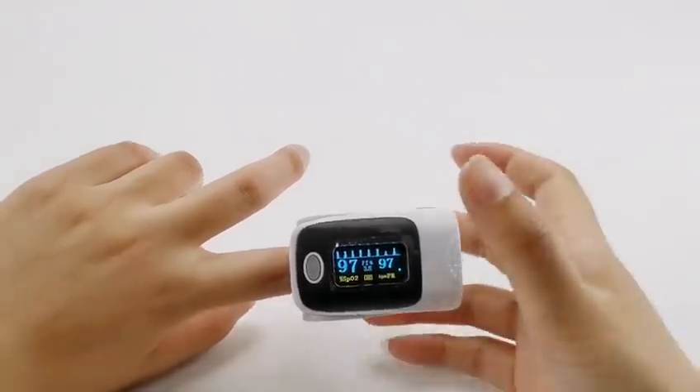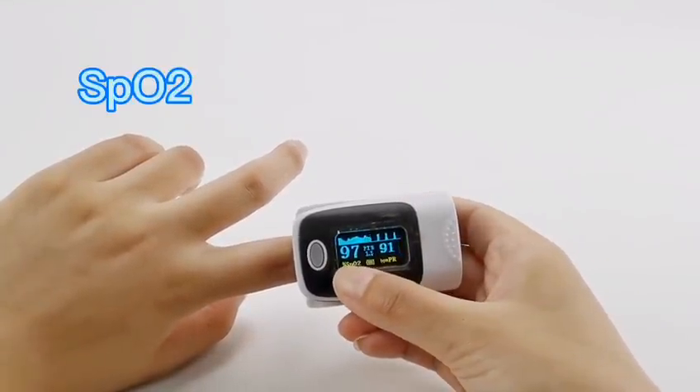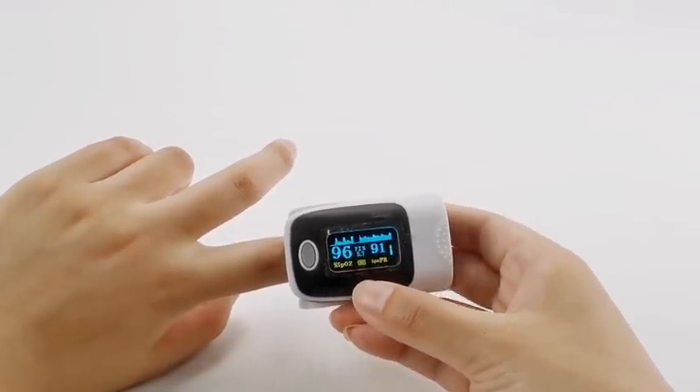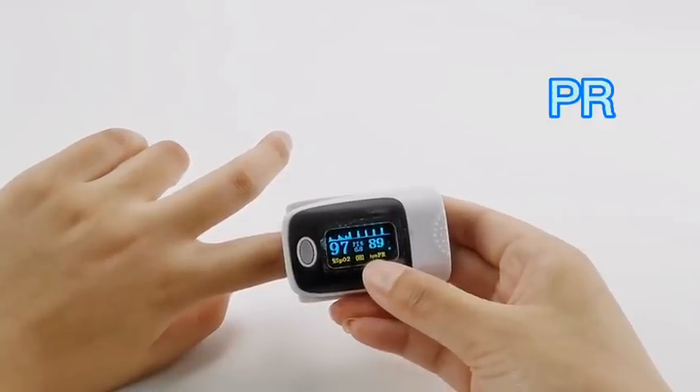The number on the left is SpO2. This is a percentage that shows the level of oxygen saturation in your blood. The number on the right is the Pulse Rate, which shows how many times a minute your heart beats.